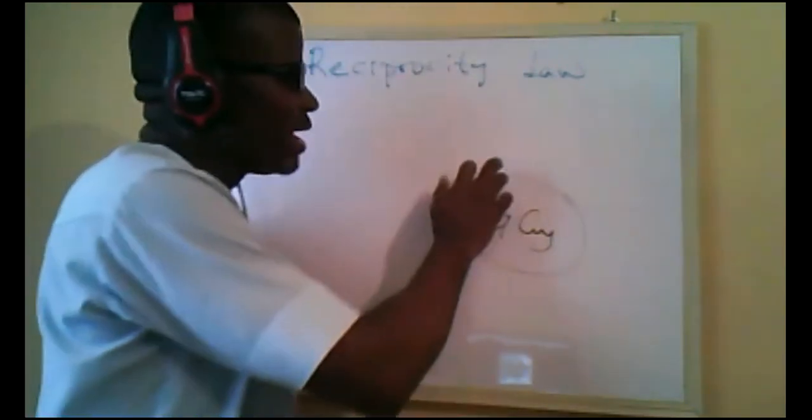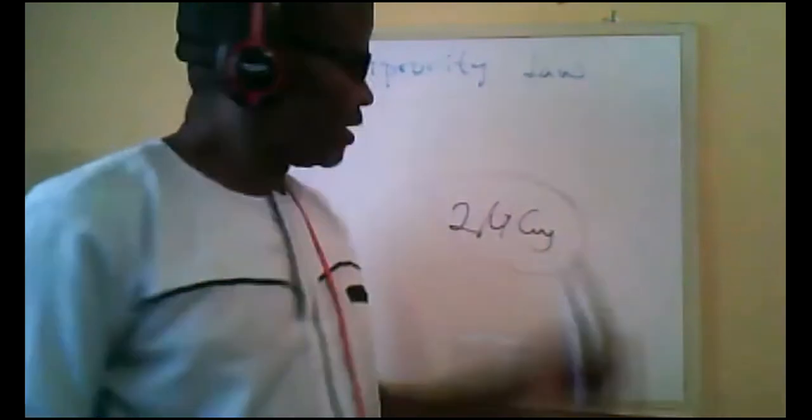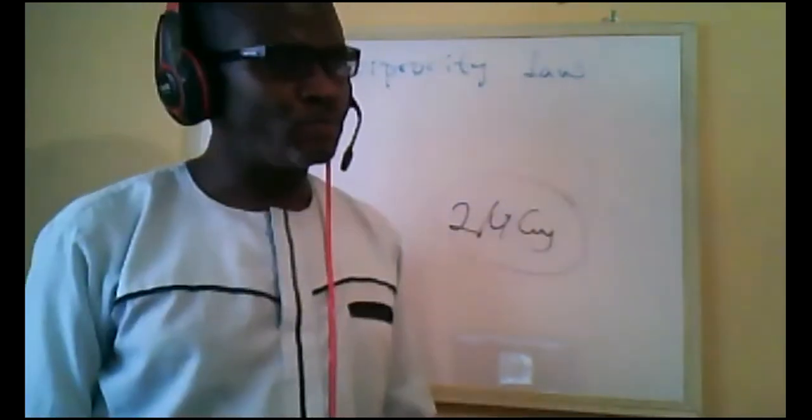We should have the same OD for this exposure, or for this dose.